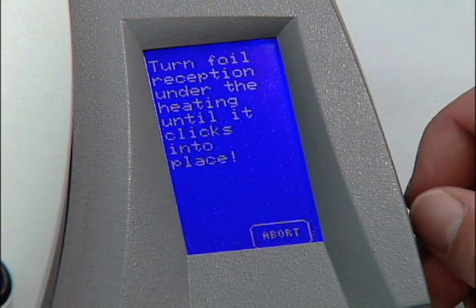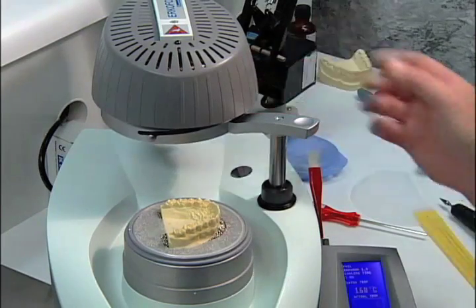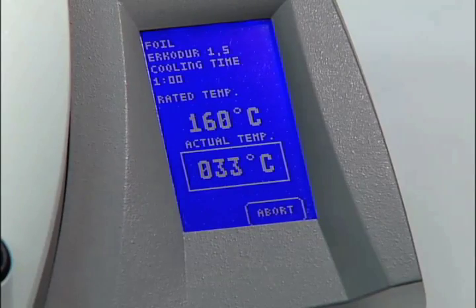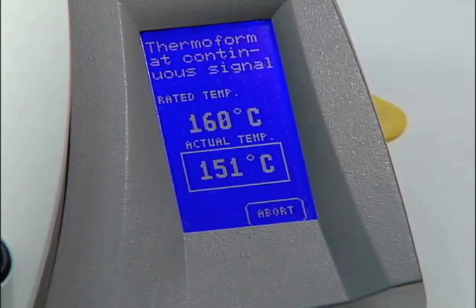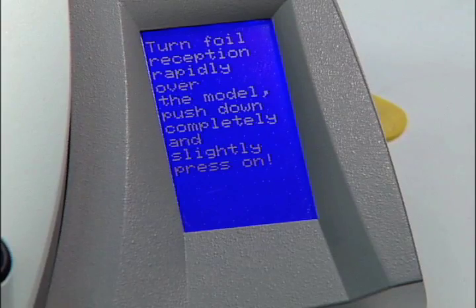You will then be prompted to turn the foil ring under the heating element. The material will begin its heating cycle. When there are 10 degrees left in the cycle, a series of beeps will be heard — no action should be taken yet. When the entered temperature has been reached, a continuous tone will sound.